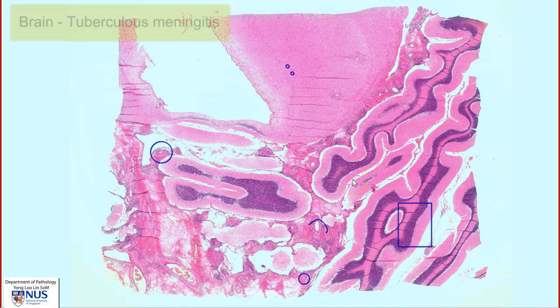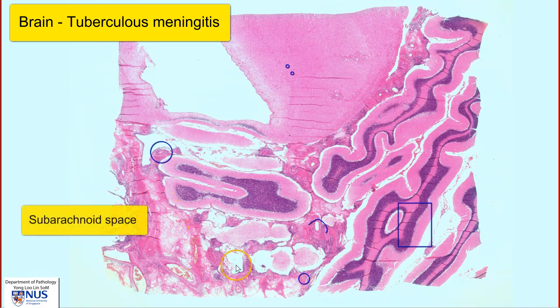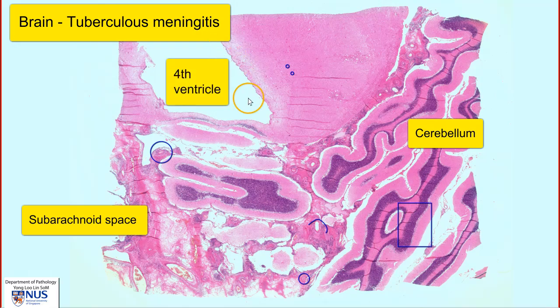This is a virtual microscopy slide of a case of tuberculous meningitis or TB meningitis involving the cerebellum. This is the area of the meninges or the subarachnoid space. Here we have viable cerebellar parenchyma, and this is the fourth ventricle.